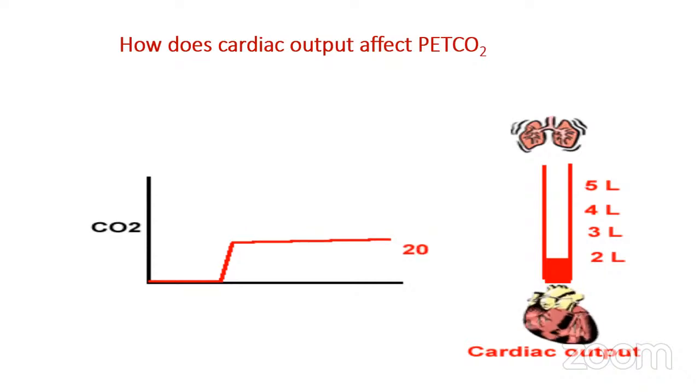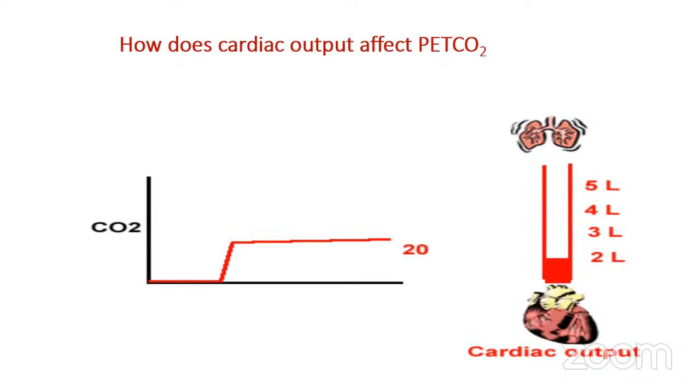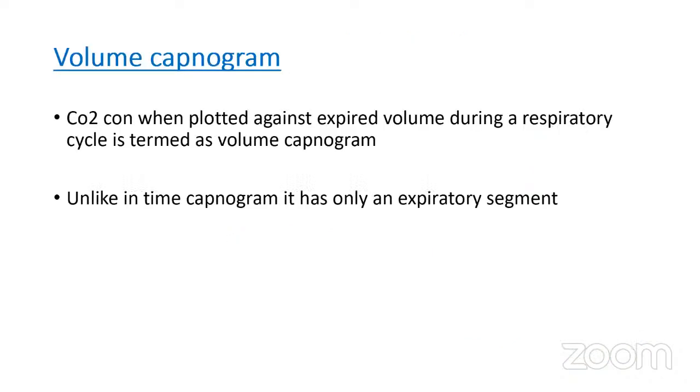So for any appropriate measurement of the ETCO2, we have to assess all these things. A decrease in the cardiac output can lead to a decrease in the ETCO2 value.